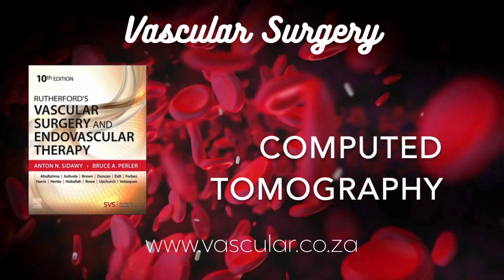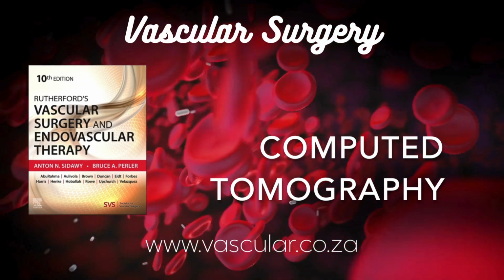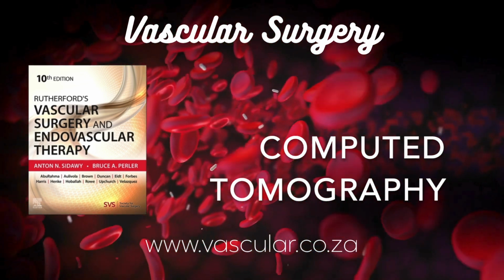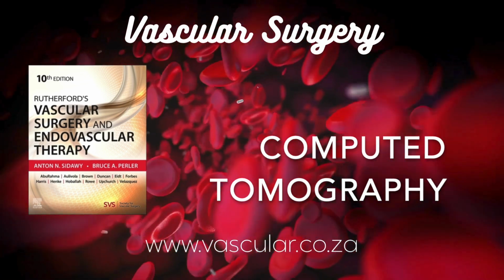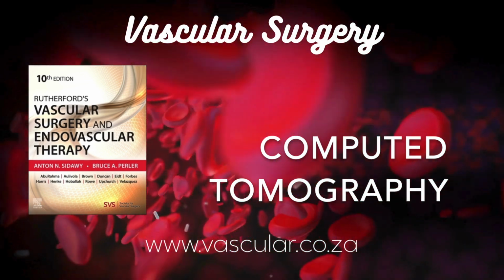Downside. In heavily calcified vessels, the bright calcium can sometimes overwhelm the image and actually obscure the view of the contrast-filled lumen inside. You might not be able to see if there's a stenosis behind the plaque. So SSD shows the surface, MIP shows the brightest stuff.